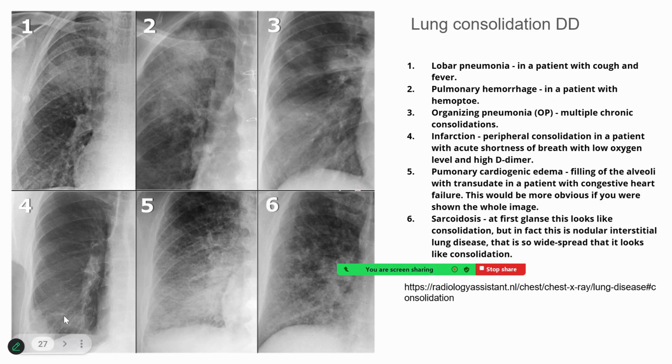Then a pulmonary infarction may also produce an opacity, but in a typical infarction, the size of the lung tissue becomes reduced. Some of the tubercular lesions may also produce a consolidation. In that condition, the size of the lung tissue should be reduced, and hence when you see the pleural line, there would be some space reduction.